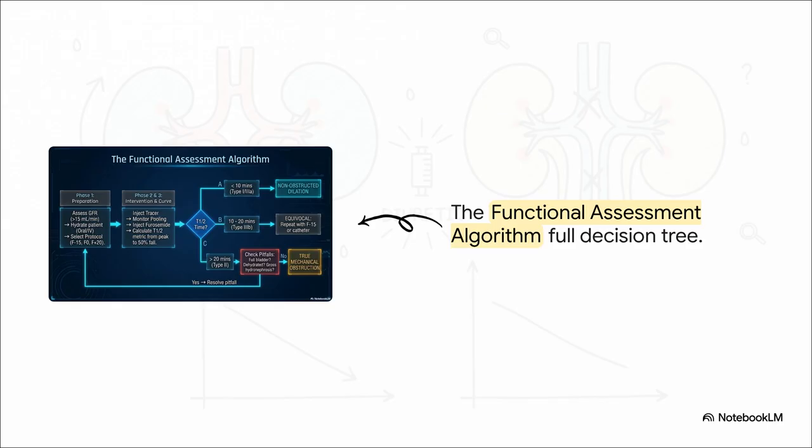Is their bladder full? Are they dehydrated? Are we looking at gross hydronephrosis? If you rule out all those pitfalls and the time is still over 20 minutes, you have your final verdict, a true mechanical obstruction that absolutely requires intervention.